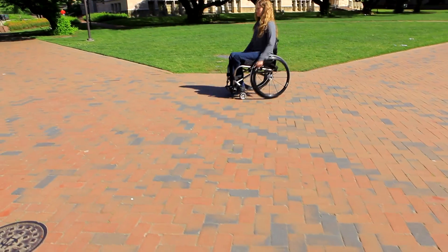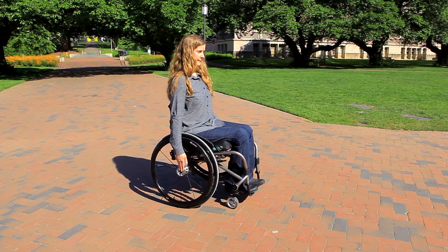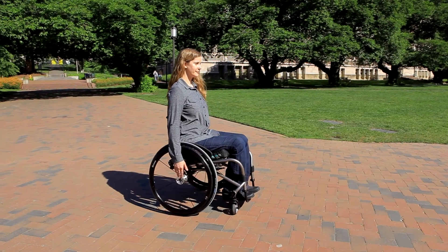If you sit too high above your wheels, you will not be able to reach the hand rims effectively. A guideline is that you should be able to touch the center of the wheel with at least the tip of your middle finger, or even your palms, when you dangle your arms at your sides.